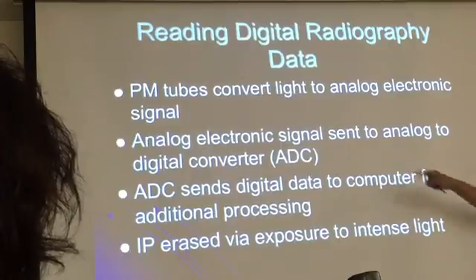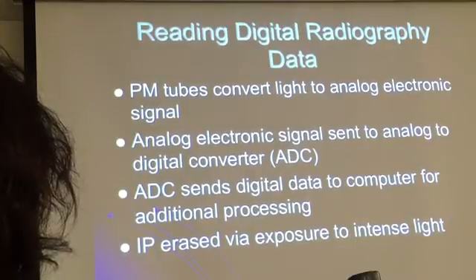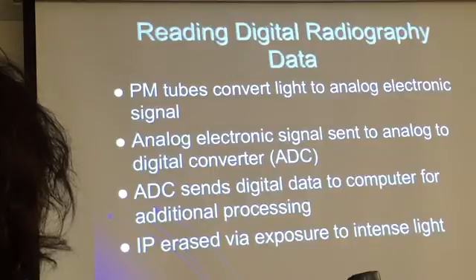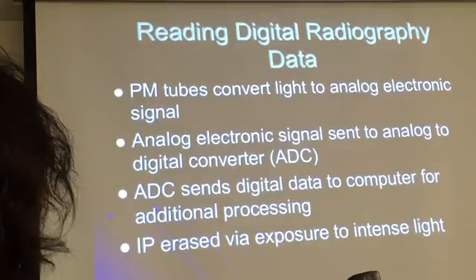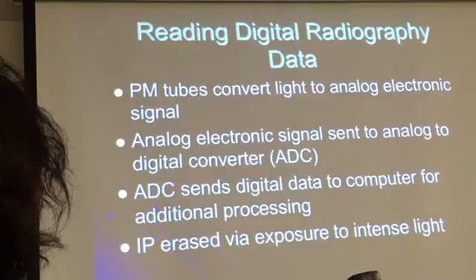But what the ADC is going to do when you send the signal is split it. Instead of being a long, extensive signal, you split it into pieces. This is easier for the computer to analyze because it can analyze one by one. And that's what the ADC is doing.